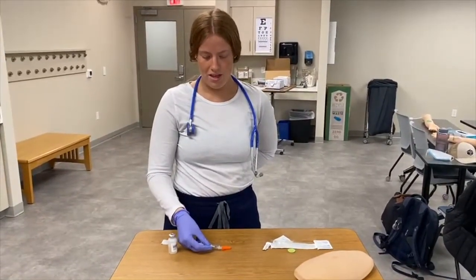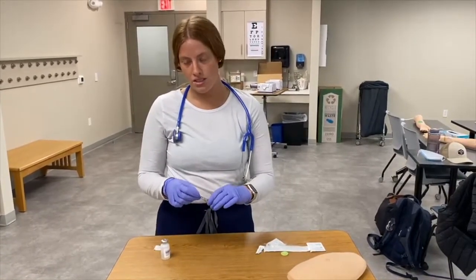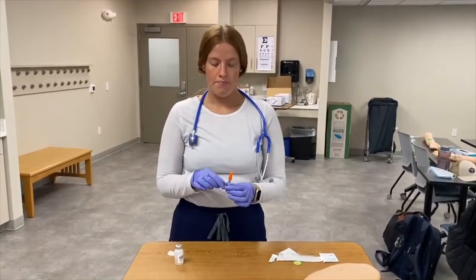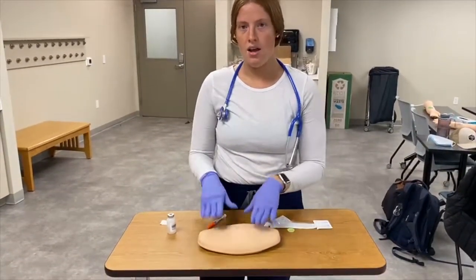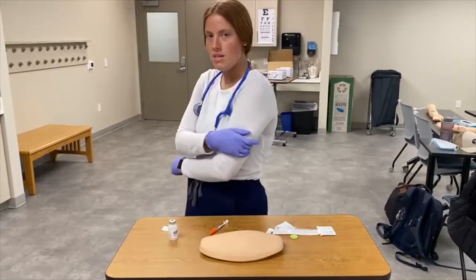To recap, even though it's not best practice, I'm going to use a swoop-and-scoop method just to prevent any needle sticks. If you're transporting this medication to a patient room, you always want to label it — because if you have multiple medications like long-acting and short-acting insulin, you don't want to get them confused. Make sure you label.